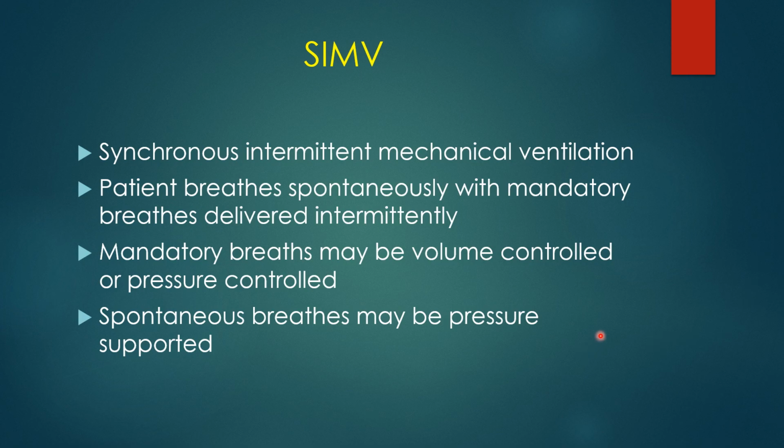But it's considered spontaneous tidal volume even though there is pressure there making him get a little bit bigger breath, because the patient is initiating the breath. He's determined the timing of the breath, how long inspiration is, and how big a tidal volume he gets. That's being controlled by the patient. So even though there is pressure support, these breaths are considered to be spontaneous breaths.